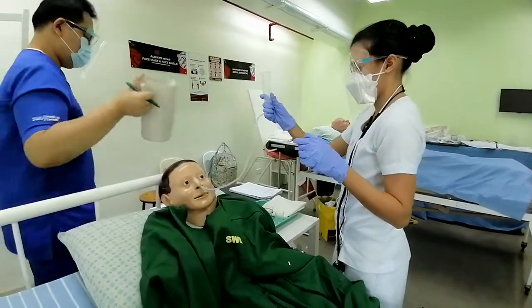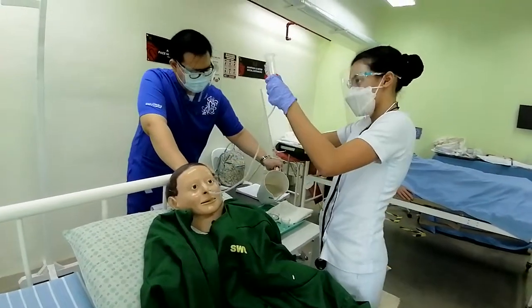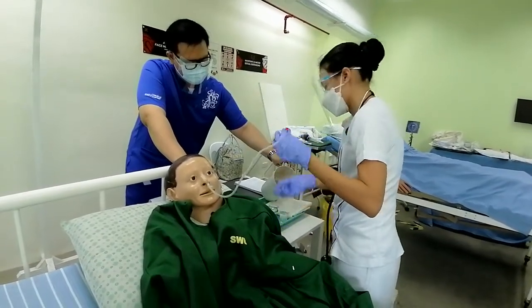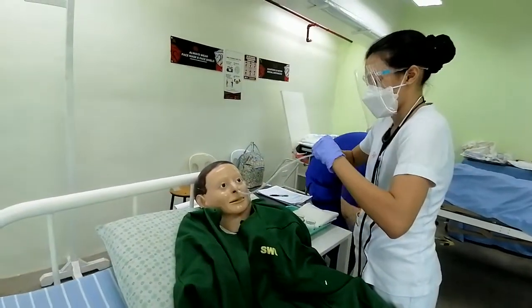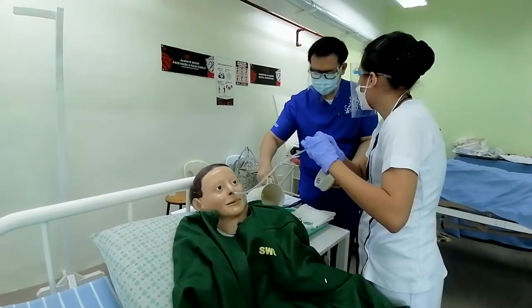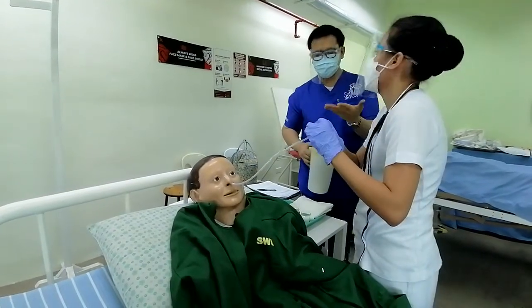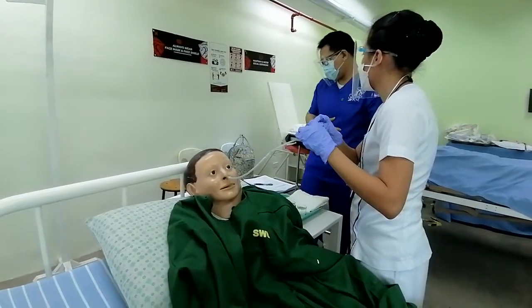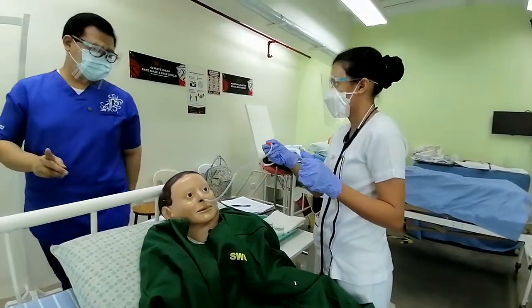Okay, next is I will clamp the end of the tube in order to prevent bacterial proliferation. The purpose of clamping is also to avoid spillage or backflow. Because the more you open it, it will drain all the secretions coming from the stomach. Remember that it can be considered as a lavage tube, right?